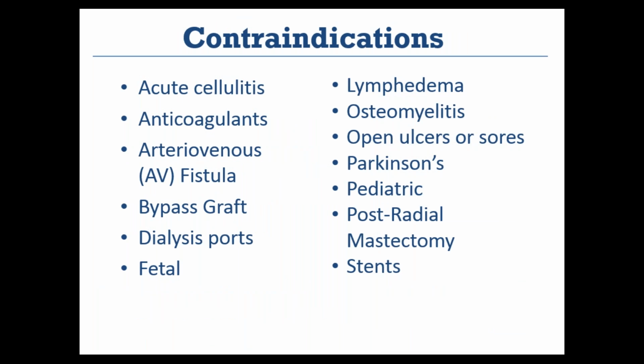Diving right in, here's a list of the contraindications. You won't need to write this down. I'll email this to everyone who's attending at the end of the webinar. I did want to take a moment to go into more depth on a couple of these because they won't all prevent you from doing a PADnet study. The first one I wanted to highlight was bypass grafts.